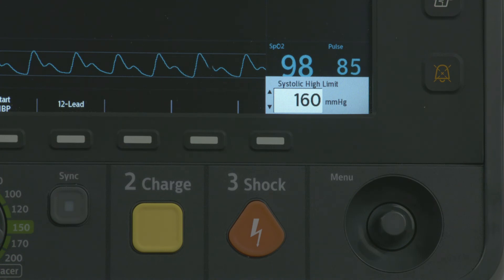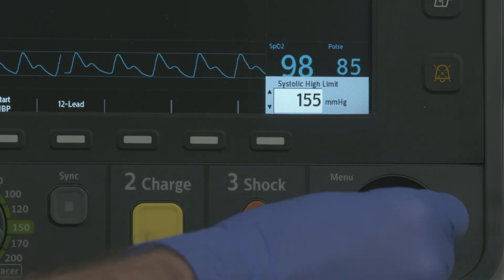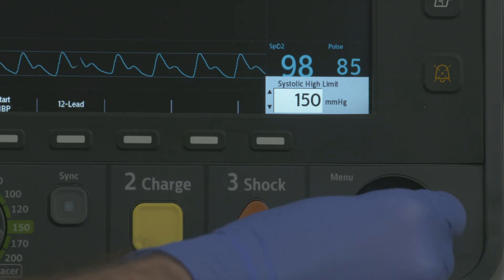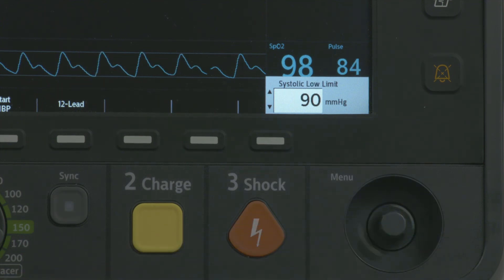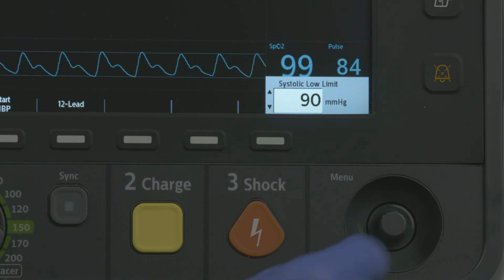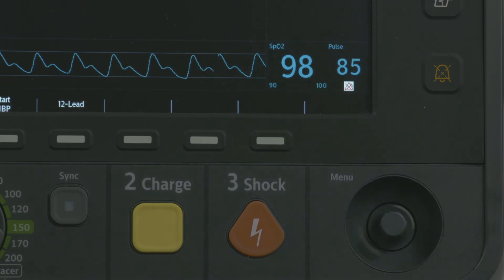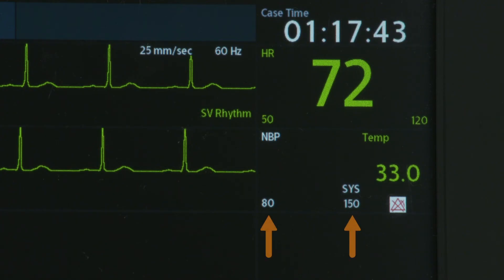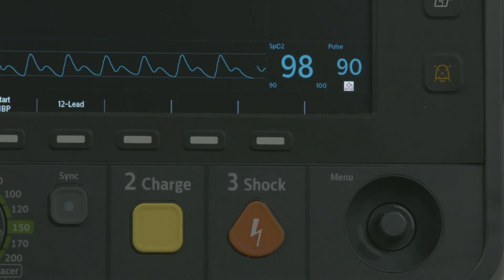The high limit appears in the window. Use the SMART SELECT knob to increase or decrease the high limit, then press it to set the new high limit. Now the low limit appears. Use the SMART SELECT knob again to adjust the low limit, and then select to set the new low limit. The current high and low limits for each measurement appear next to its measurement numeric.